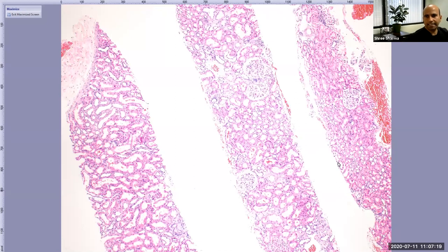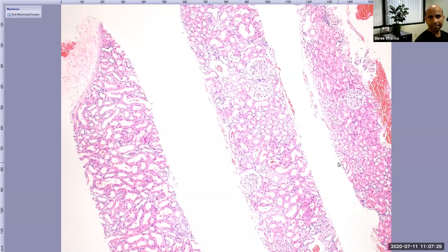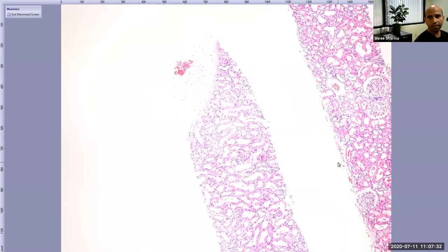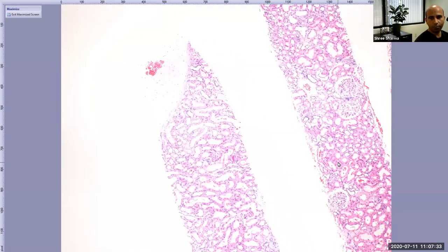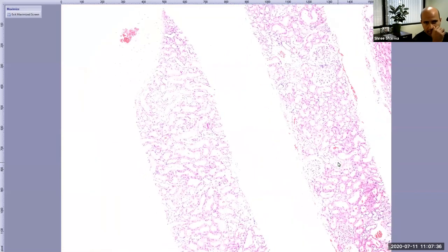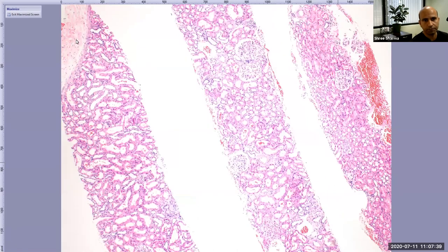So you all can see my screen. When we start reading a kidney pathology, we start with a microscope. We put the slide on the microscope and look at it. This is the low power. When you look at the slide on low power, you screen whether the kidney is present or not — that is the first thing I will check.